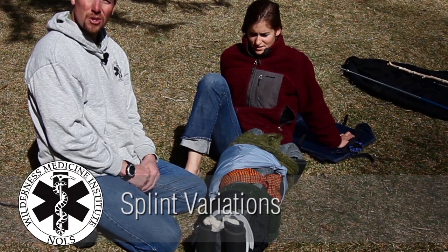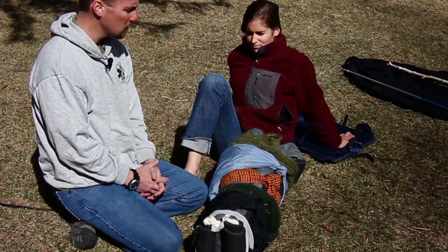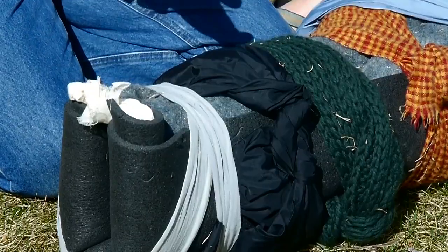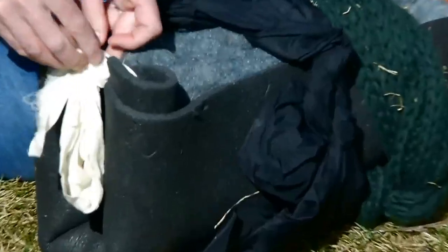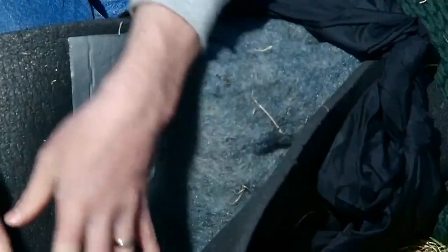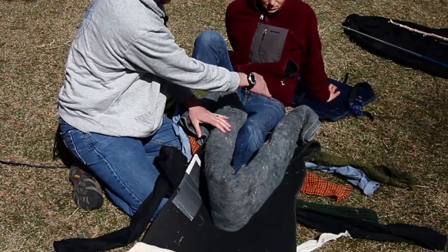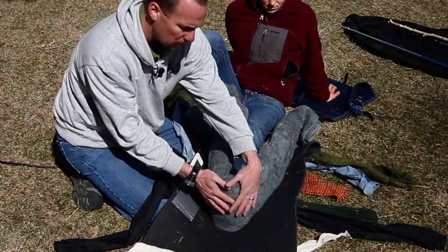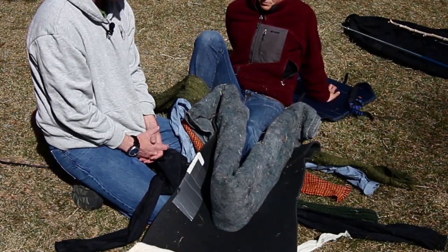We're going to deconstruct a few other options for a lower leg or tib-fib splint. We've got jackets and scarves — all wide and able to provide good compression. What we have down here is a roll that's been tied off in an ensalite pad, so that can come up and create a little bit of support underneath Kay's foot. On the inside, we've got a wool blanket that's been wrapped in a horseshoe shape that comes all the way underneath Kay's foot, around her ankles, and all the way up to provide padding so that there's no movement inside the splint itself.